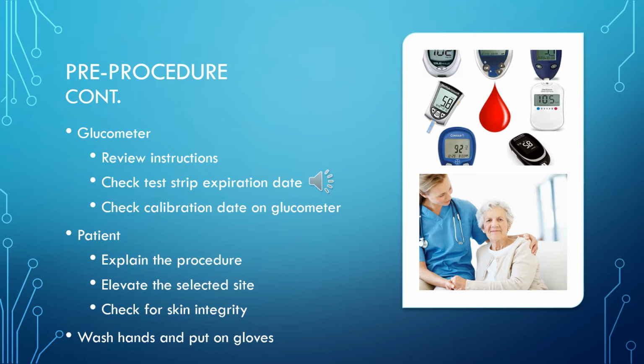As you can see in the picture on the right-hand side on the top, there are numerous types of glucometers on the market. Each one has specific ways of operating, so we need to be aware of that again before we take it into the room.